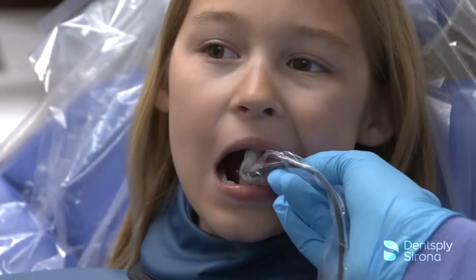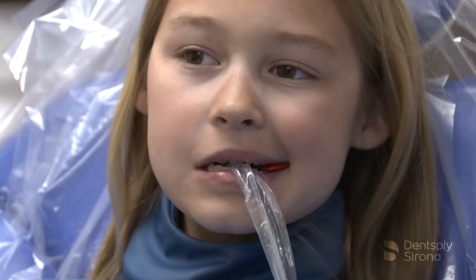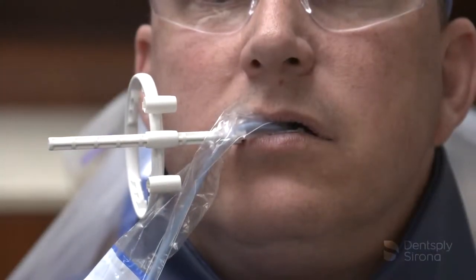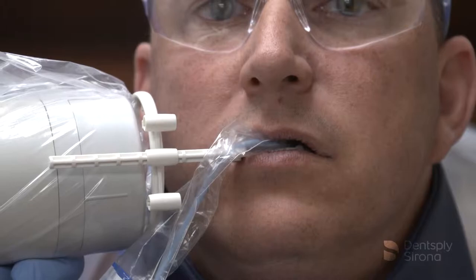Position the holder in the patient's mouth, have the patient close slowly, and align the x-ray tube using external landmarks and the optional positioning arm and ring if desired. Take the exposure and adjust as needed for the next desired position.